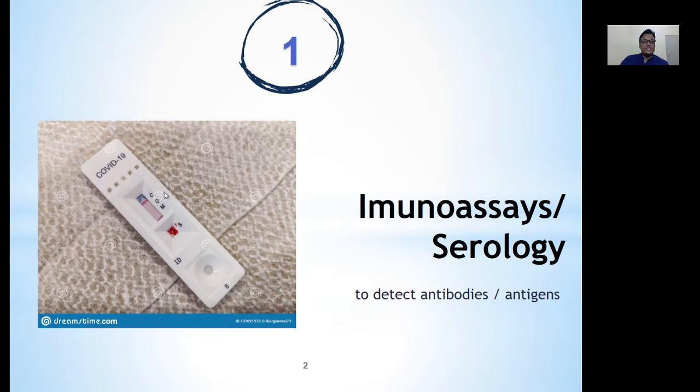So luckily for this patient, both are negative. That means he has not been infected by COVID-19 yet. Or it can be used to detect specific antigens.